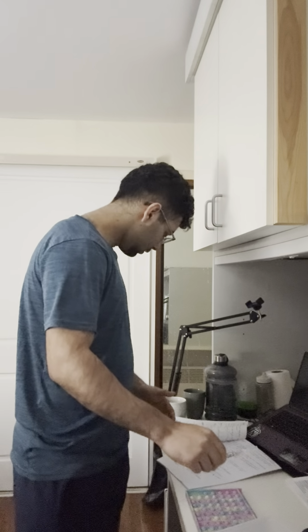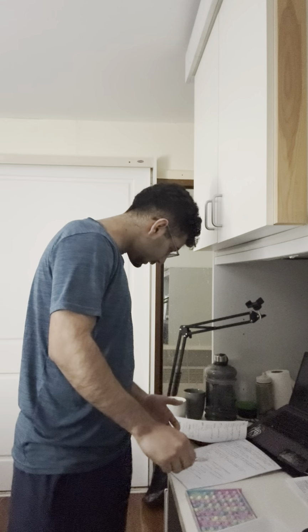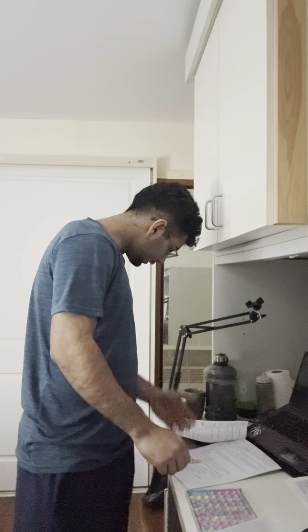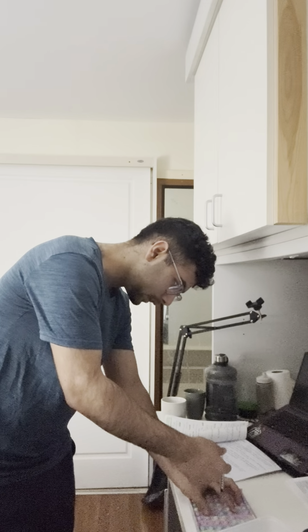And then you're going to tell her, third check done. For subcut we have to pinch the skin to get the fatty layer, right? So I'm going to hold it like this, take it out, and I'm going to go in slowly, and wait for some time, maybe 5 to 10 seconds, so that the skin can absorb everything, right?